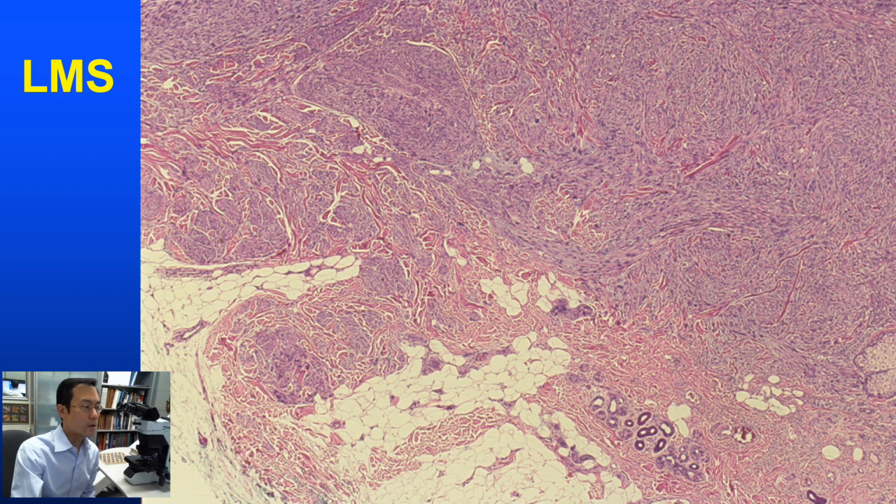In leiomyosarcoma, we have very compact, irregular fascicles of atypical spindle cells, a little bit more of an infiltrative pattern of growth in many areas, such as the periphery of the tumor here. And even from medium magnification, I can make out these large basophilic aggregates, some or all of which surely correspond to large atypical nuclei and or mitoses.